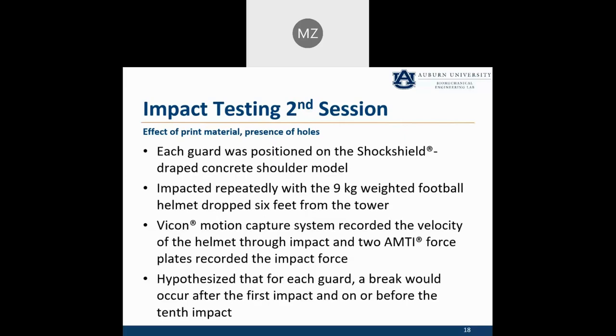Same type setup, we use the shock shield liner again. This is a really good simulation of soft tissue, so we felt happy with that setup. We had to get a new helmet because the last one broke, but we weighted it with the original weight of 9 kilograms again.